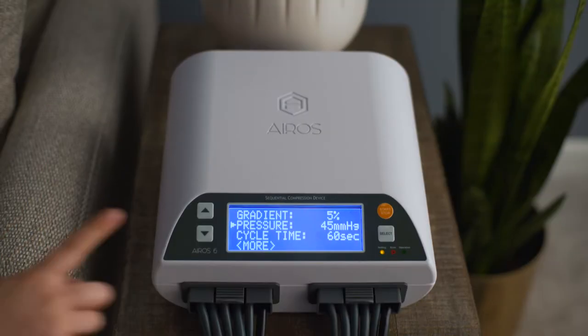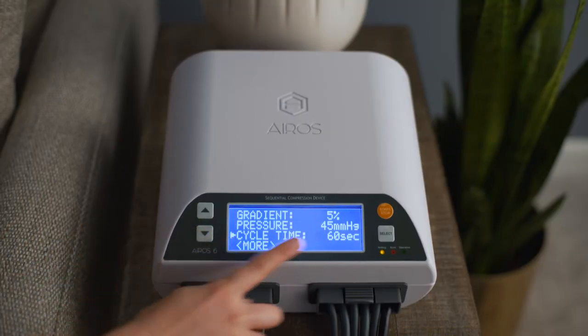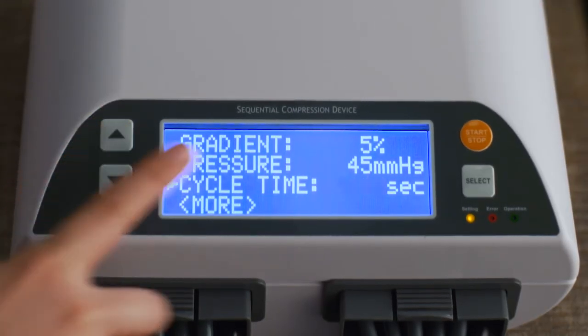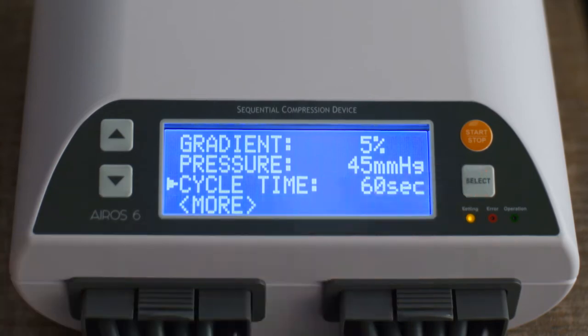To set the cycle time, scroll to Cycle Time and press the Select button. Cycle time can be set at 40 or 60 seconds. Press the Select button to confirm your selection.